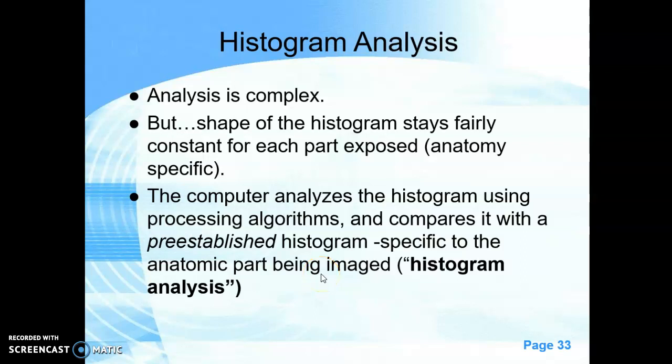This is part 2 of the histogram analysis lecture. So I left off saying that analysis of the histogram is fairly complex and it can get very detailed in all the readings that you might do. But we should know that the shape of the histogram stays fairly constant for each part being exposed. Another way to say that is that it is anatomy specific.